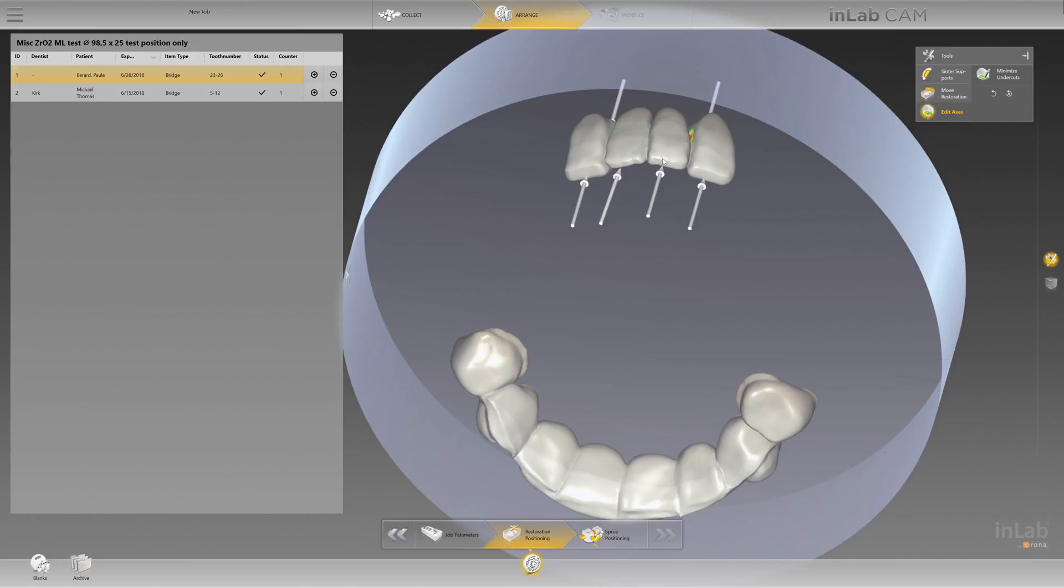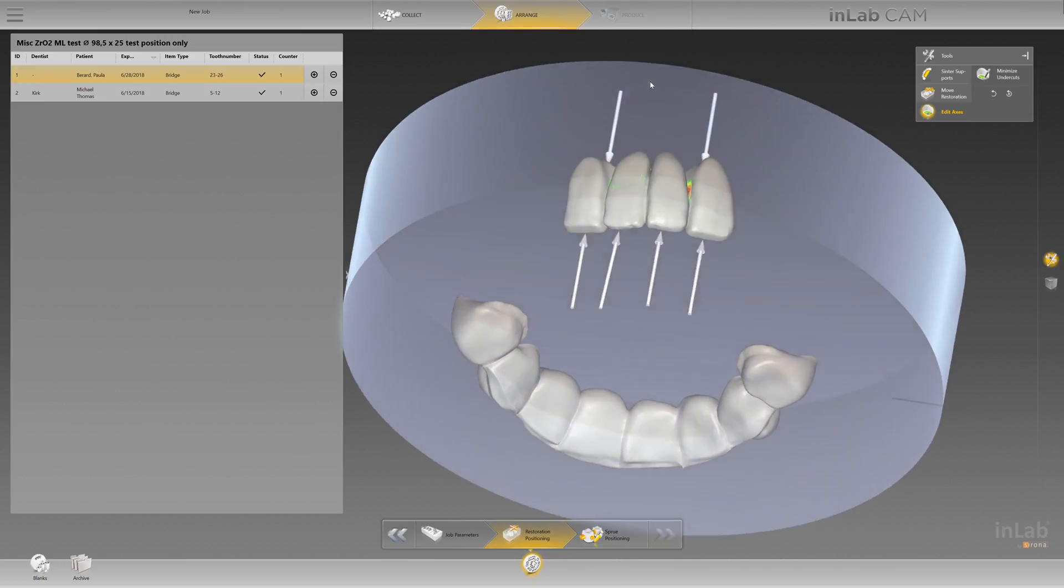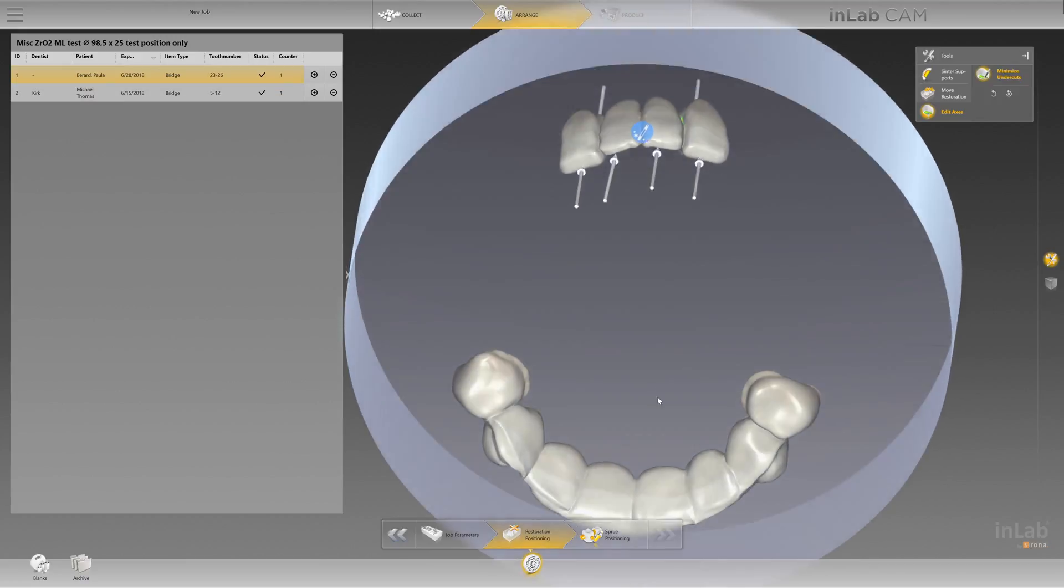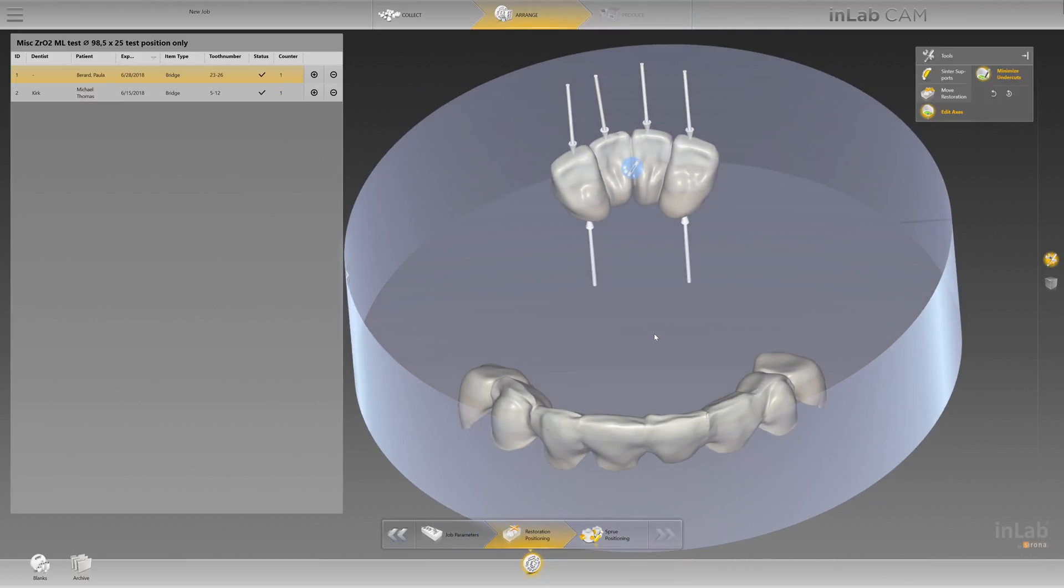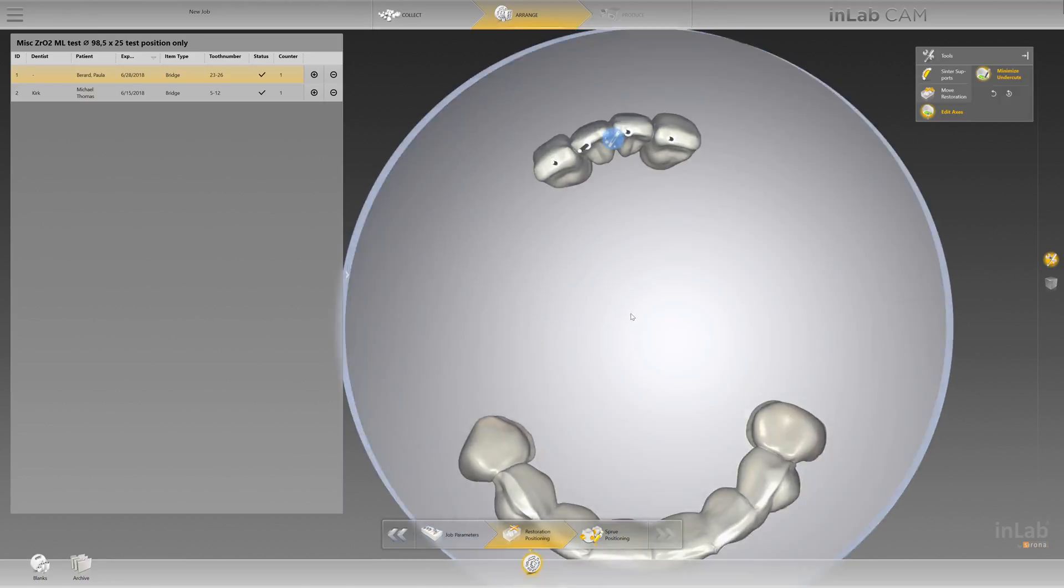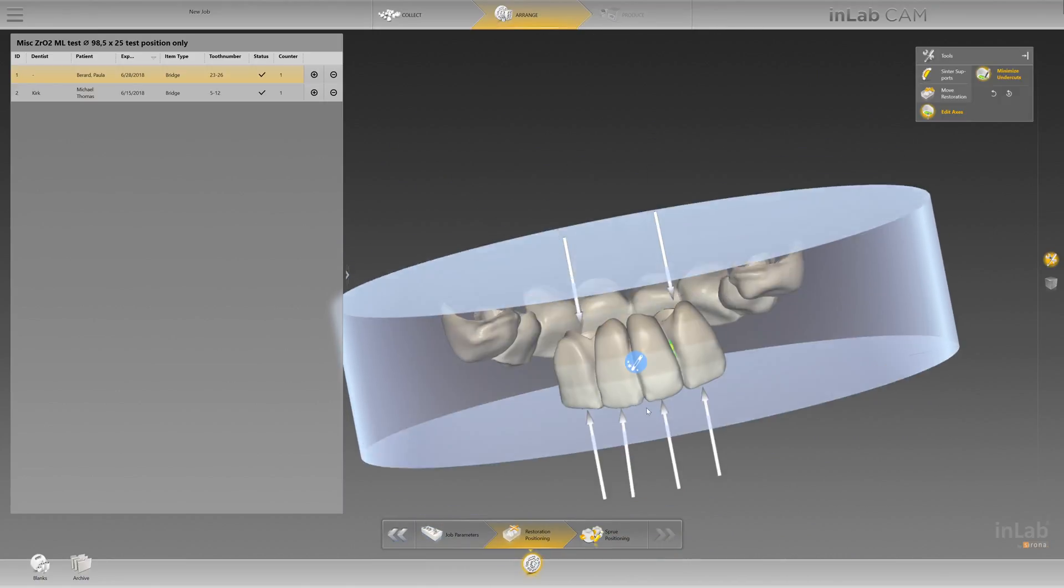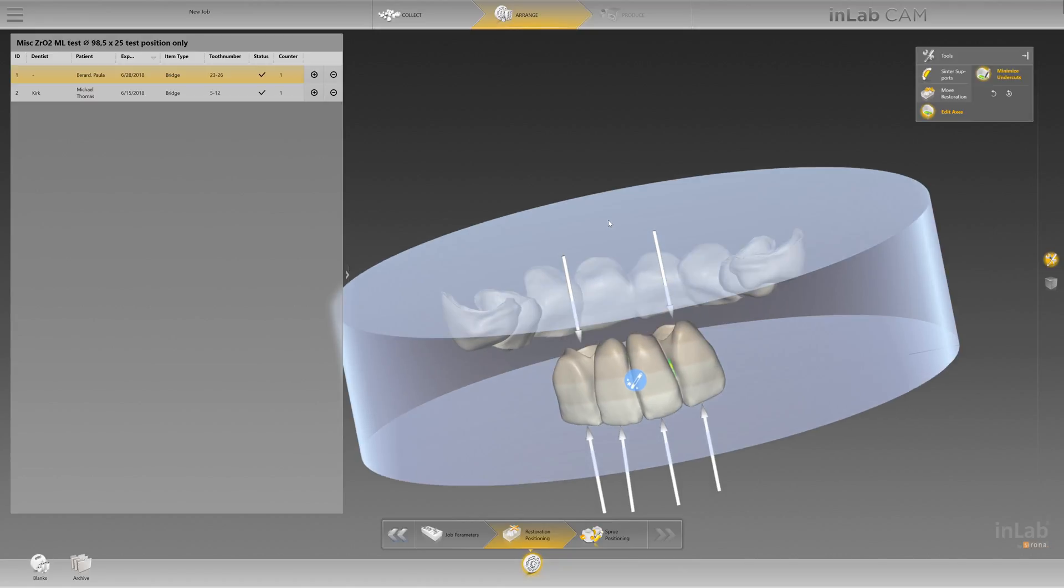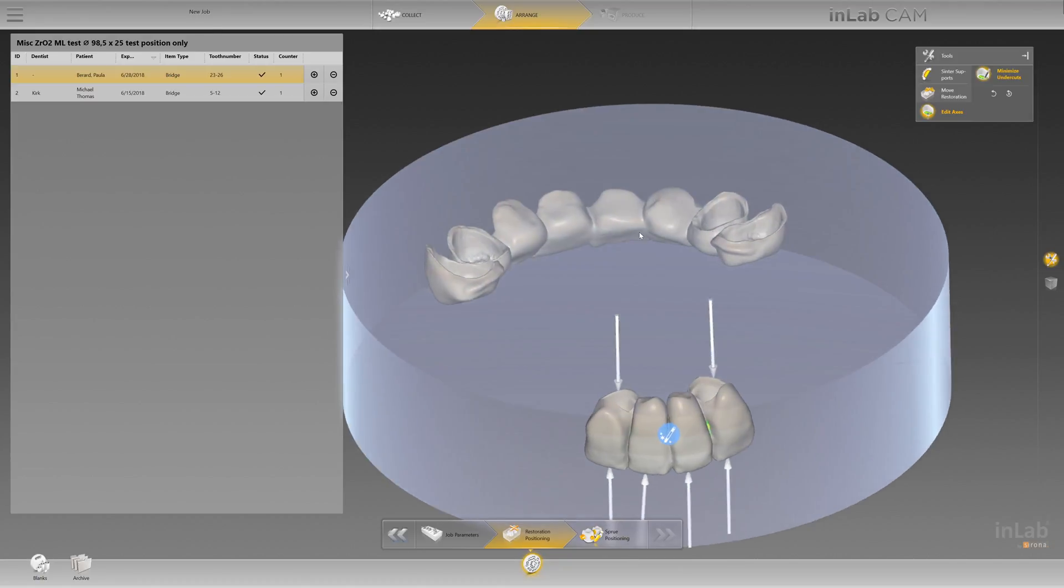Now you do have a little magic button - what I like to call magic button anyway - minimize undercuts. If you click on minimize undercuts, it will try to optimize its milling. It works pretty well, I must say, but it'll still identify these areas that are just not possible for the machine and its availability to mill.